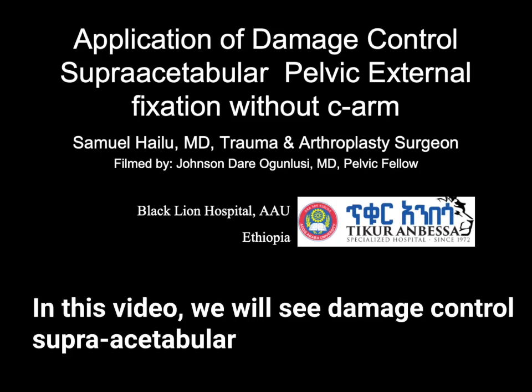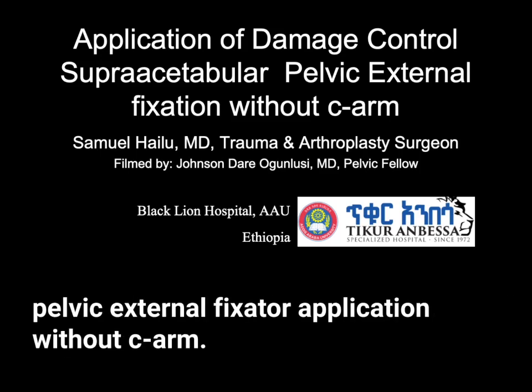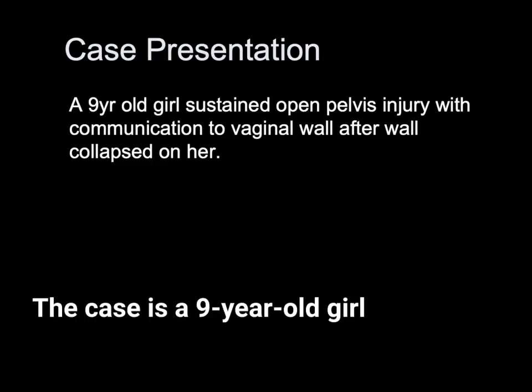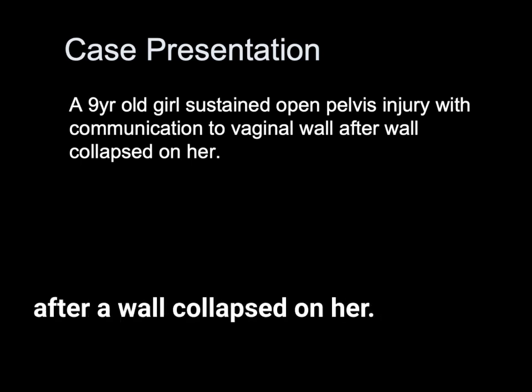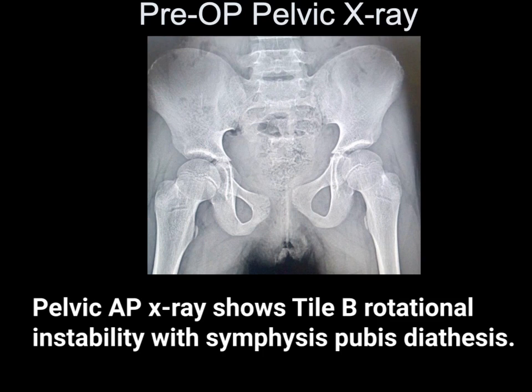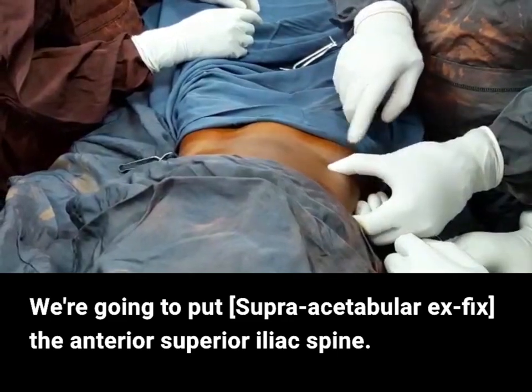In this video, we will see damage control supra-acetabular pelvic external fixator application without C-arm. The case is a nine-year-old girl who sustained an open pelvic injury with communication to the vaginal wall after a wall collapsed on her. Pelvic AP x-ray shows type B rotational instability with symphysis pubis diastasis. We're going to put a supra-acetabular external fixator.